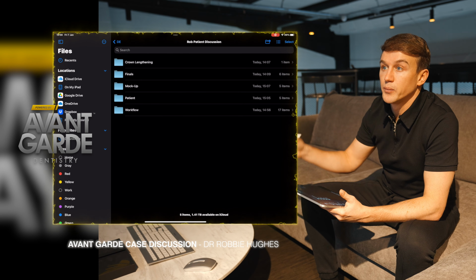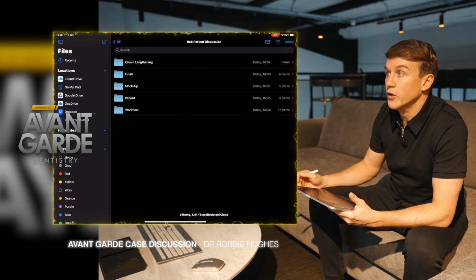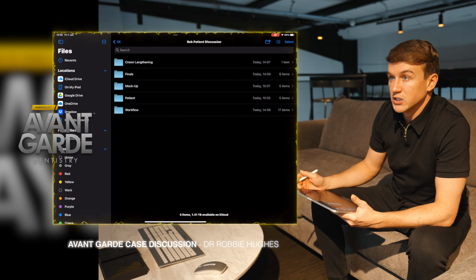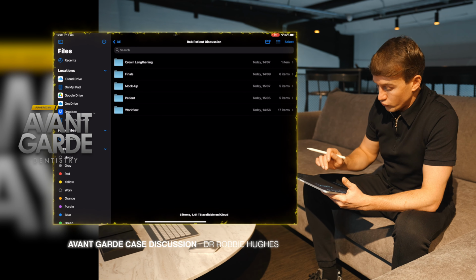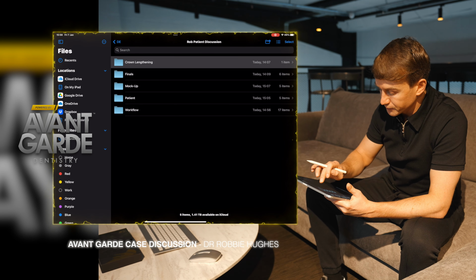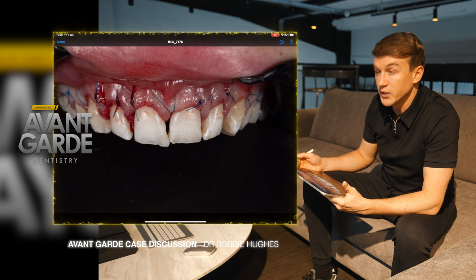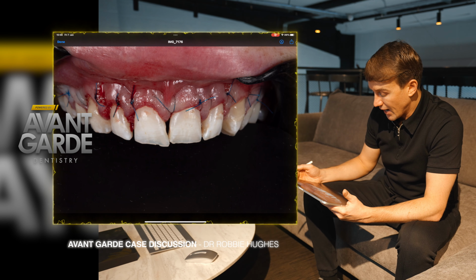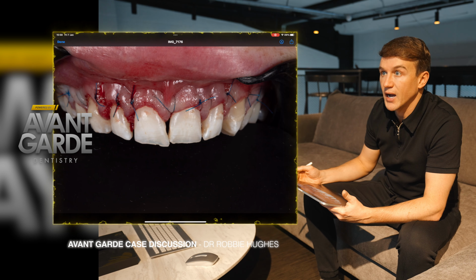He'll use a scalpel, or he will use a laser to scallop around the mock-up and create the new shape for the gingival position, and then he will raise a flap and remove the necessary bone for the crown lengthening procedure. And just a quick image, this is our image on the day after crown lengthening, and you can see already the new heights and the teeth are starting to take shape with regards to the height to width ratio and proportions.